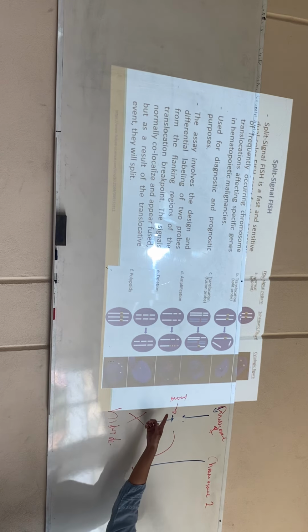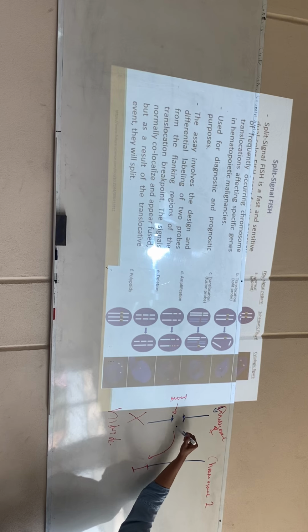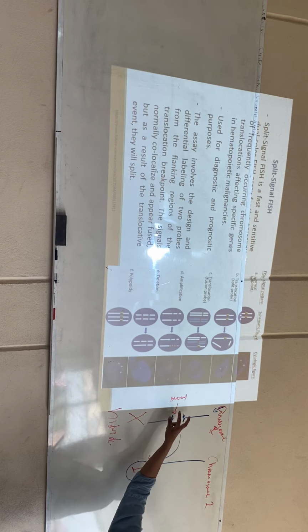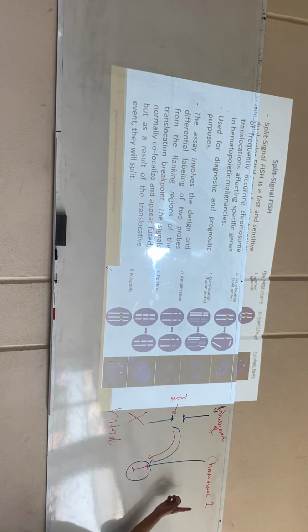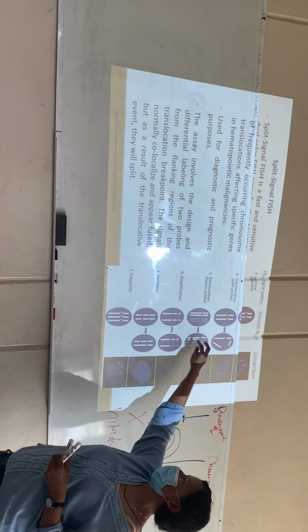If the same probe is incubated with another chromosome and is showing a signal in another chromosome, that means that this region was translocated or moved into another chromosome. So in this way, I can do two types of analysis. I can look for the absence of fluorescent signal, or I can look for the presence of fluorescent signal in another chromosome, and I can determine a translocation present in there. Those are the two examples that we have here.